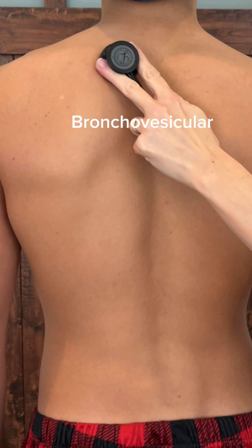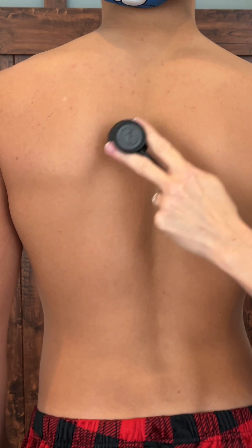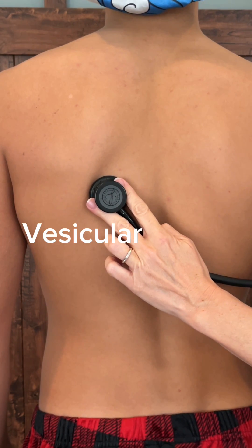When you're listening to the posterior back, up in the scapular area you will hear bronchial vesicular sounds. And again, you're moving from side to side, listening for the full inspiratory and expiratory breath on each side.